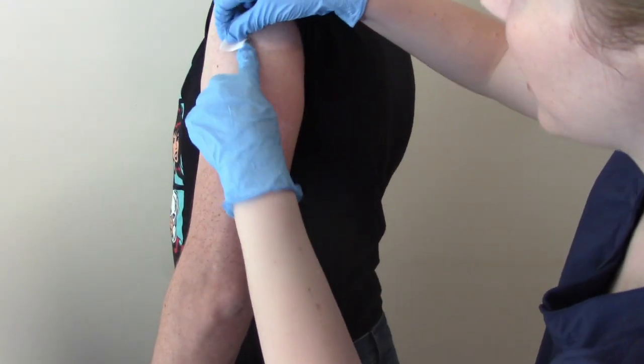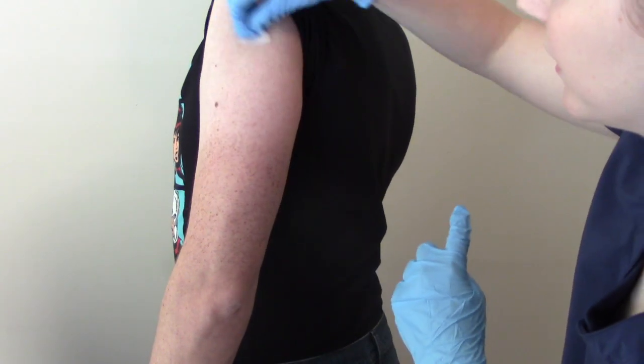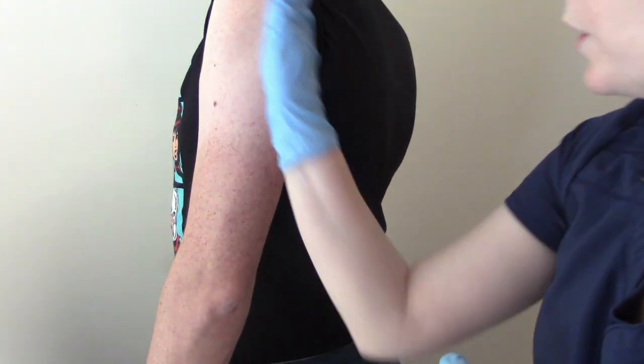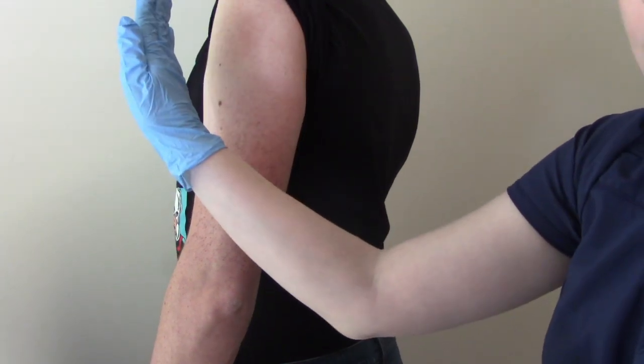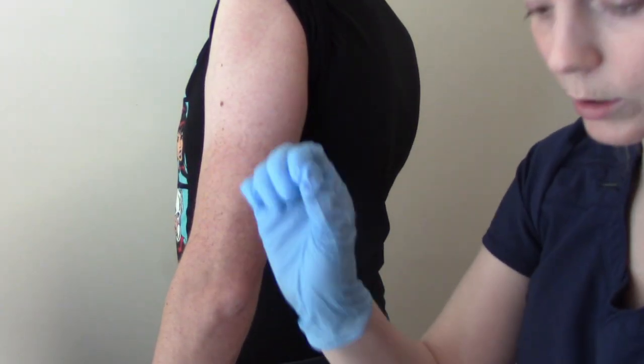Let's alcohol it off. When we use the Z-track method, we're going to use our hand to move the skin while our other hand holds the needle.